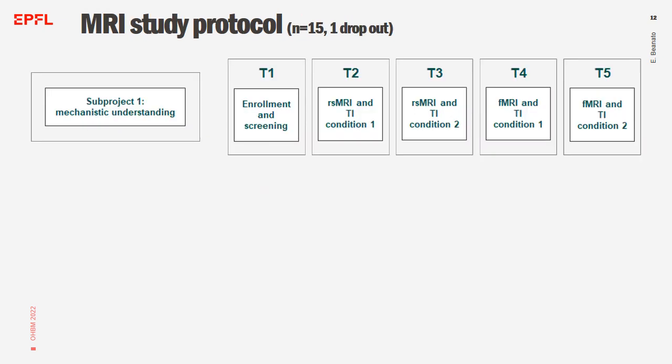In the second part of the study, we asked the subjects to perform 2 task-based fMRI sessions. During the acquisition, participants had to perform a motor learning task, namely the sequential finger tapping task, with their non-dominant left hand. This was chosen since it is an established task in the field, able to well study motor learning curves.